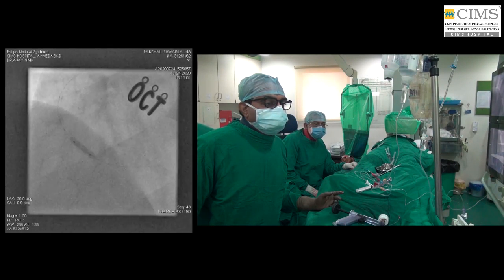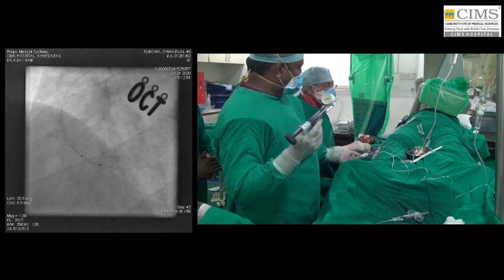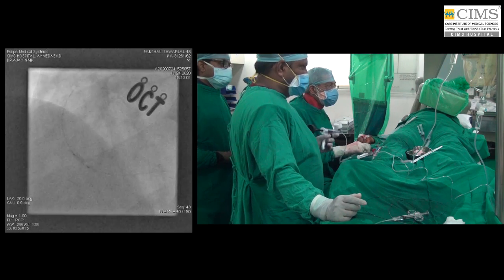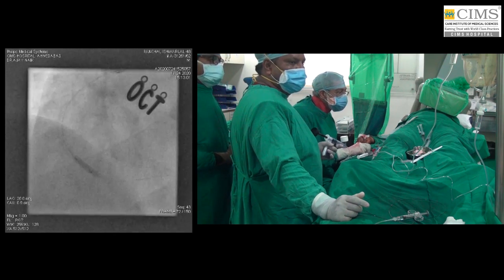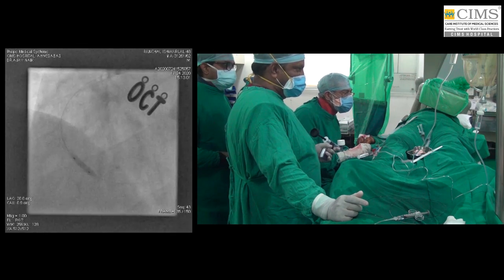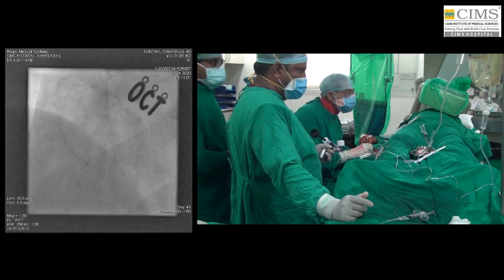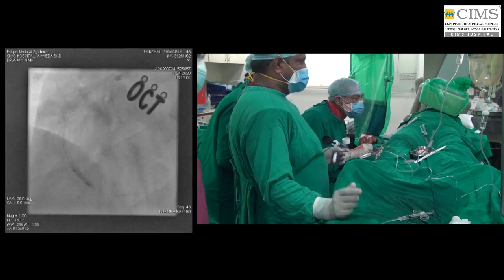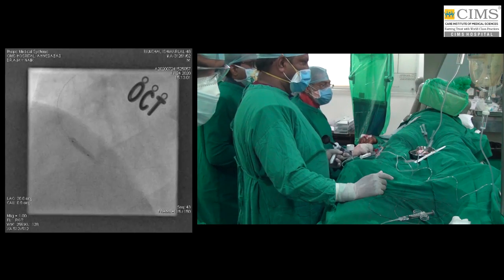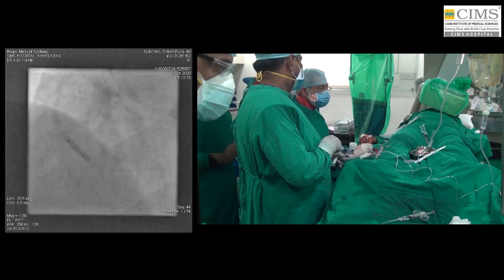And we are going at nominal pressure, even below nominal, and then as we go proximally, we go to higher pressure on the NC balloon, and at the proximal part of the stent where the artery is 3.25, we will go as high as 16 atmospheres with the NC balloon.